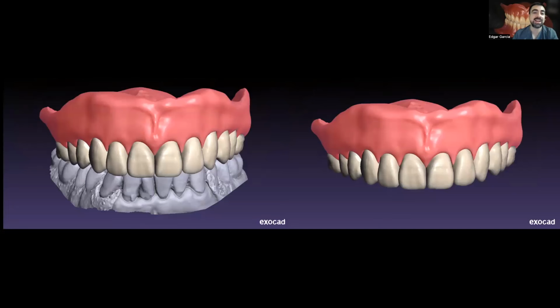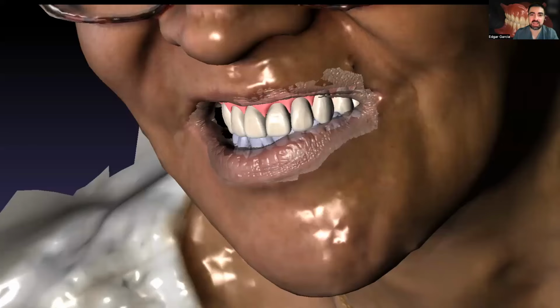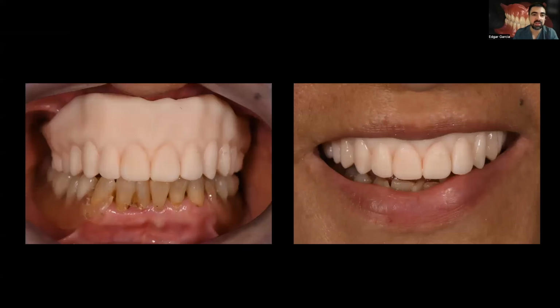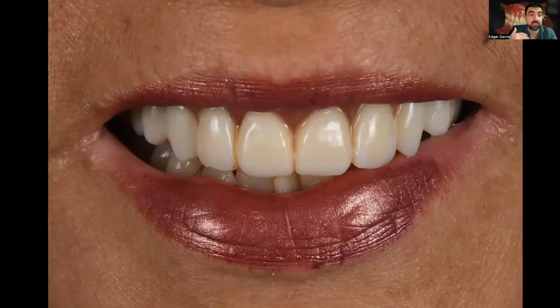In this case, that was not the case, but I designed a denture with the requirements of the patient. As you know, aesthetics is subjective. I designed these teeth with the patient beside me. Design, the prototype, the printed base and the printed teeth. I have a lot of retention doing this by only scanning.